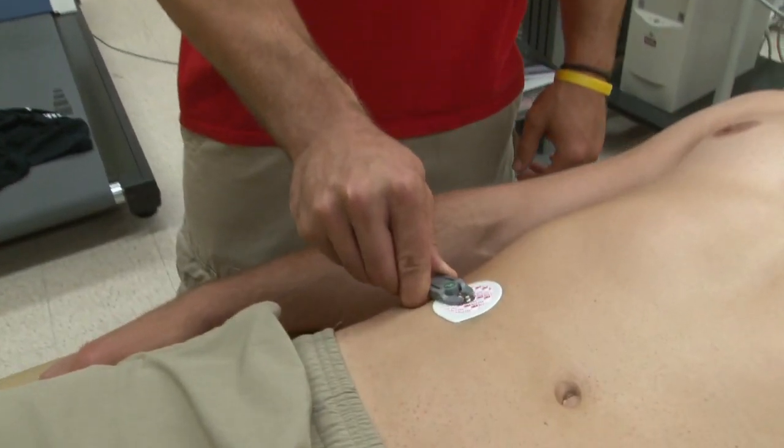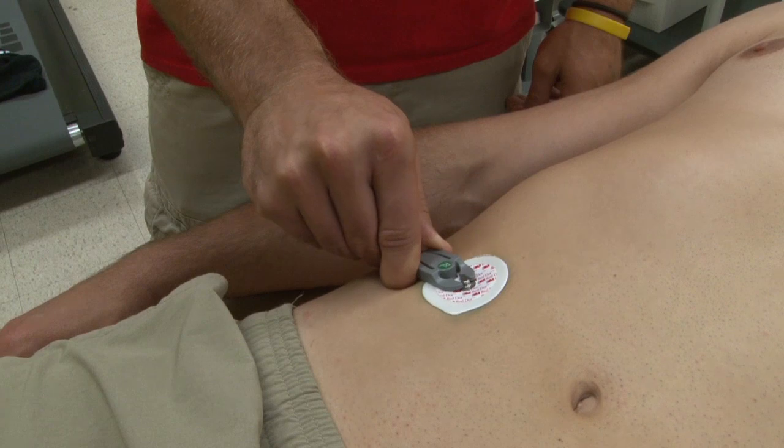Now that we have all the electrodes placed, next we're going to apply the wires to each electrode. Each wire is labeled to what site you applied to. So this one says right leg, so we're going to apply it there. Just a note, this is the ground lead in the ECG.